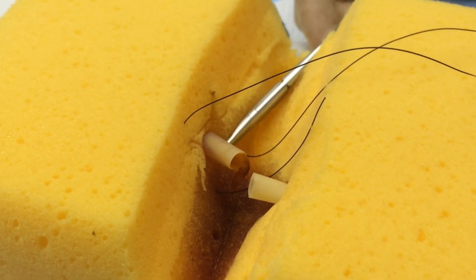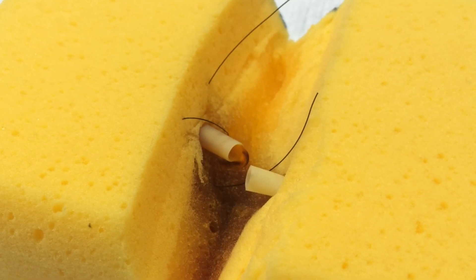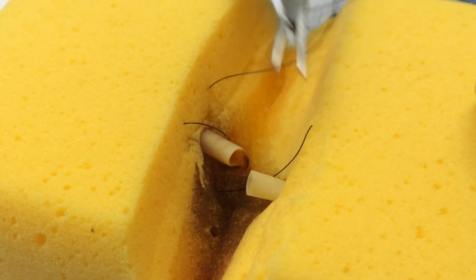Your next throw will again be deep to superficial, this time on the other side of where you note that bleeding blood vessel. The assumption here is that you don't clearly see the end of the bleeding blood vessel, but rather what you see is where the bleeding source is coming from.